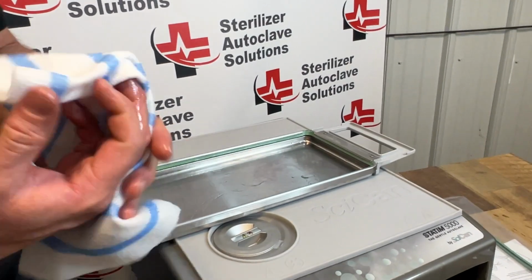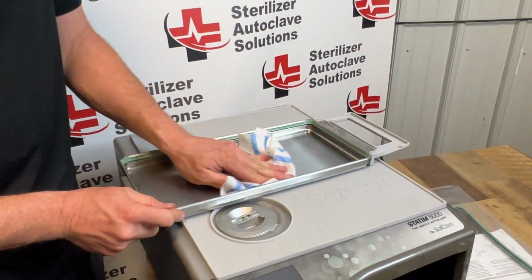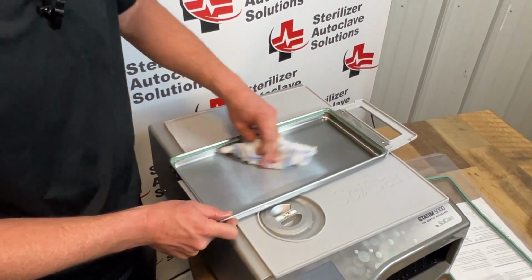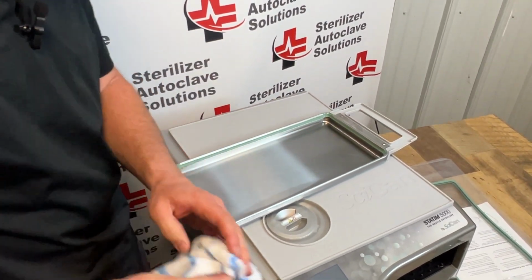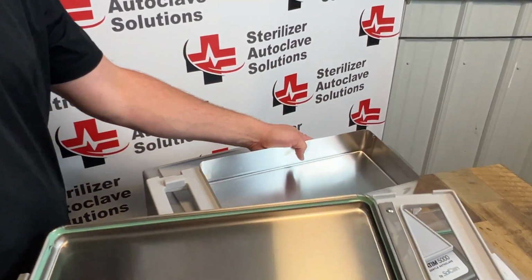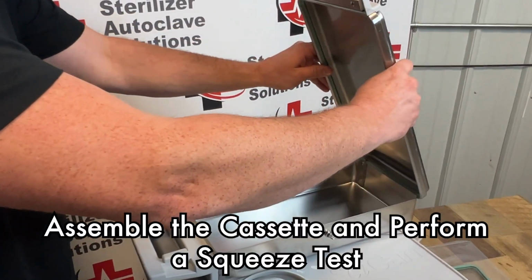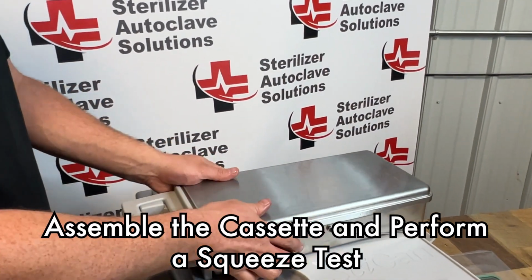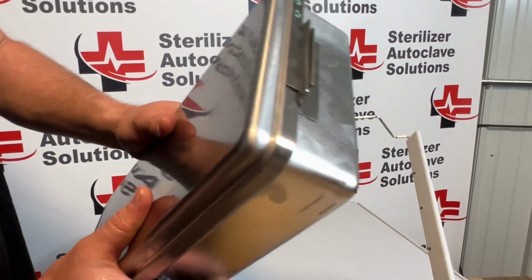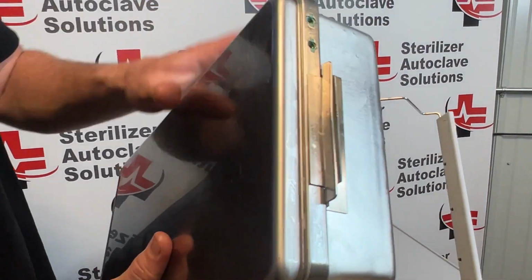Last, what I'm going to do is wipe out the cassette. You can use Stat Dry to help take some of the oil out of your cassette and make it dry a little faster. Putting the top back onto the bottom. I'm going to slide it in, and we're going to try the squish test. You should hear air whooshing out of the back.